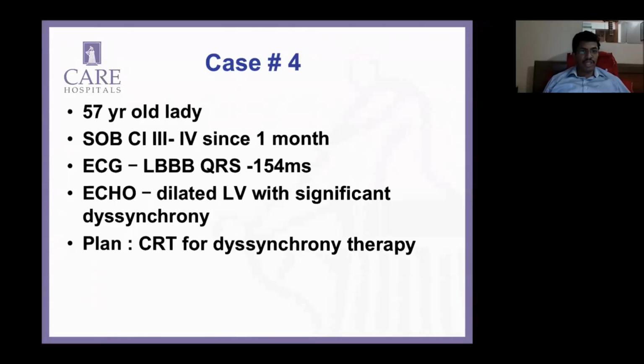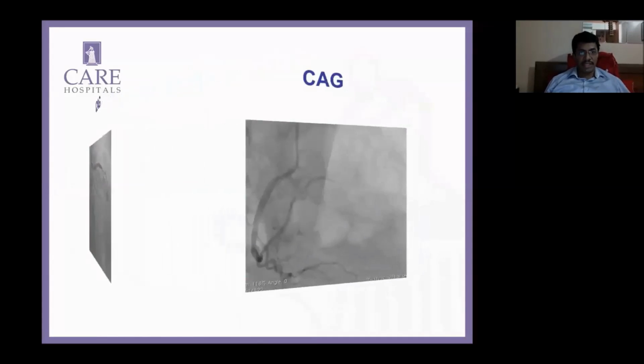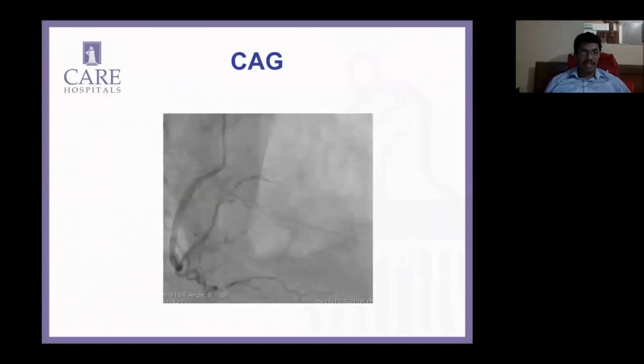I didn't put in that she's also diabetic. So the normal thing is we went ahead and just did an angio. This is a still picture of the left system. Looks pretty normal. I'm not really worried about the branches here, but at least LAD, LCX, OMs are fine. The RCA also looking okay. And then we sort of came out, normal coronaries, near normal coronaries.